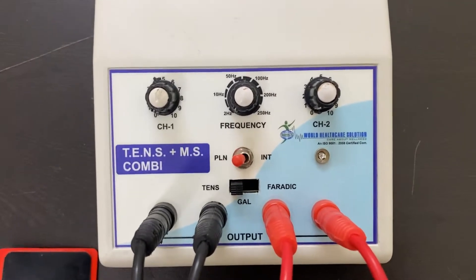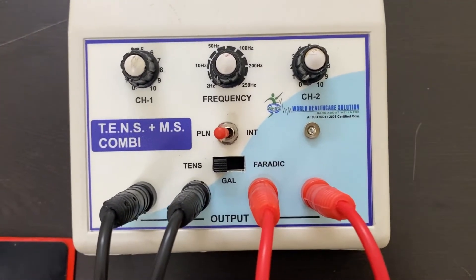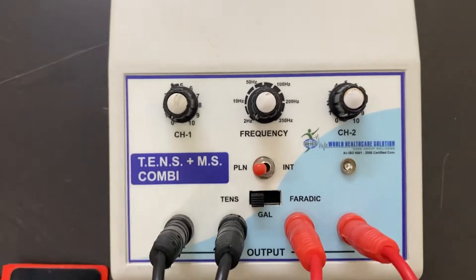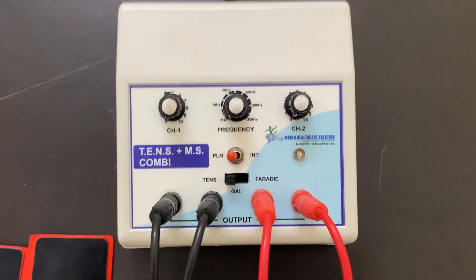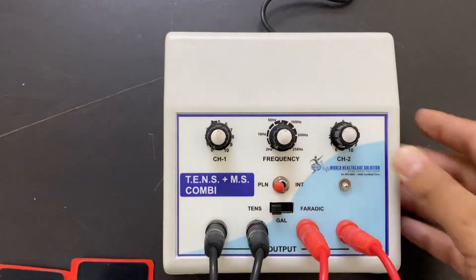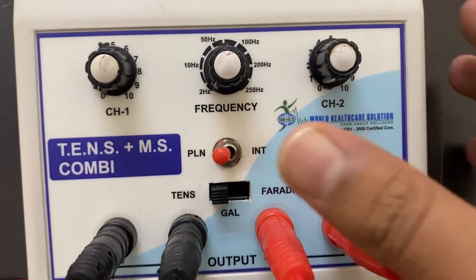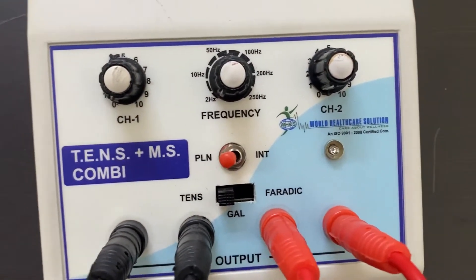The mini model includes three different modes: one is TENS, the second one is galvanic, and the third one is Faraday. Let's begin with the TENS mode. First, switch on the machine. The TENS mode includes two different modes — one is plain and the other one is intermittent.